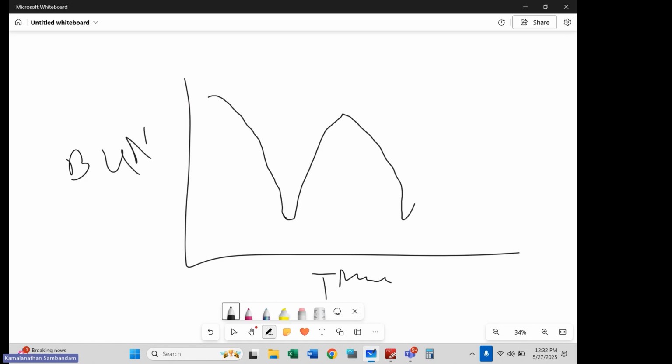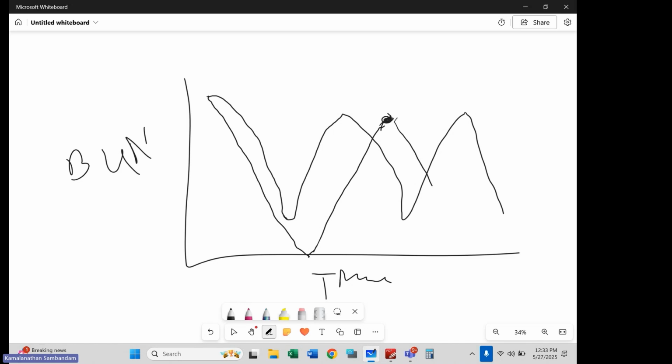I would drop it, it would rise. Obviously, the drop should be more abrupt. This is not totally accurate. Now, if I were to do 2 dialysis treatments a week, then I would need my urea concentration to drop much lower in order for me to achieve the same peak urea concentration on this twice dialysis prescription.